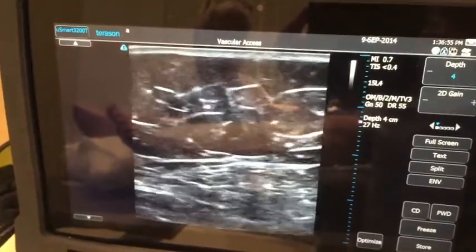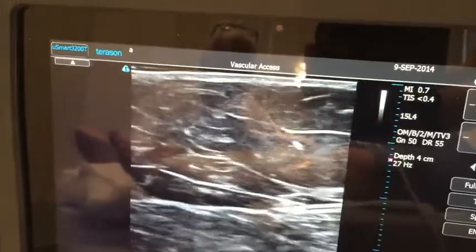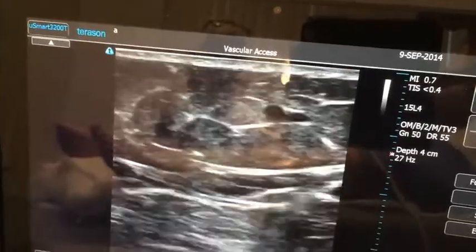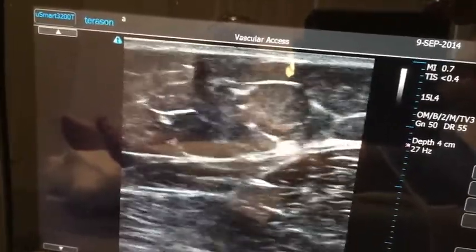Now, this is a vessel that's feeding a lot of these complexes. It comes from that — it's a little perforator coming way down here. It gets larger up here. It comes up and gives rise to multiple branches that travel up to the complex.